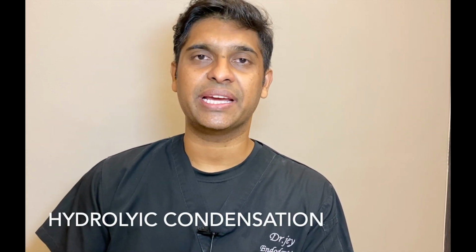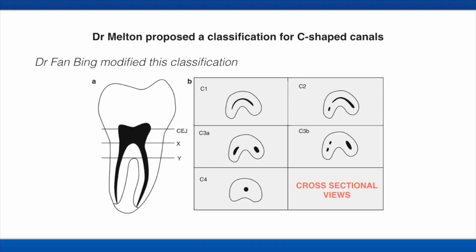Okay, so once we activate and disinfect the canals, next, if the tooth has an infection, could be small or large, I always prefer to go in for a 2-visit procedure in case of infected root canals. I use calcium hydroxide, and it's very important that the entire canals are filled with calcium hydroxide. And then comes obturation. For obturation, my preferred technique is the hydraulic condensation technique, where I use bioceramic sealers with single cone GPs. If you're a person who uses a resin sealer, you could use your resin sealer with warm vertical compaction techniques.